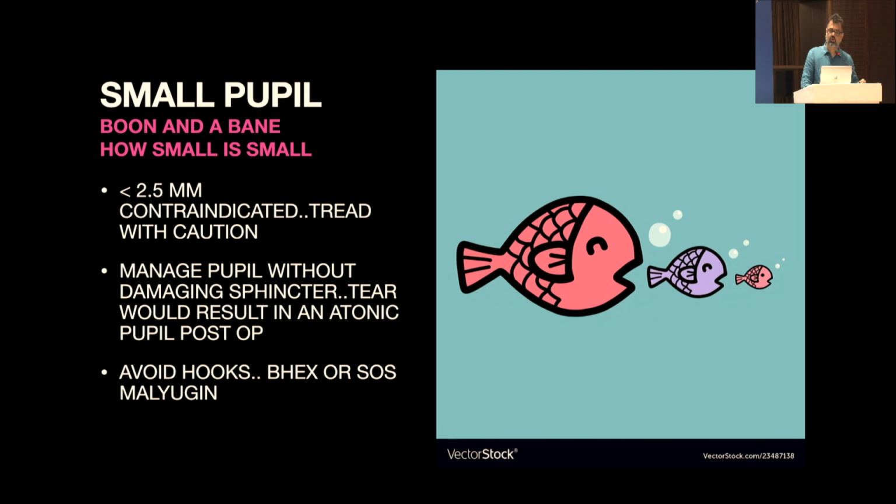So you have to be almost 100% faithful with the technology, and you should have the conviction in your advice and surgery to be sure about the results that you would give with these presbyopic correcting IOLs. Thank you.